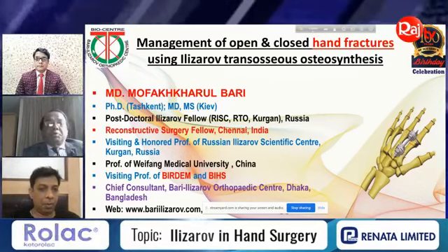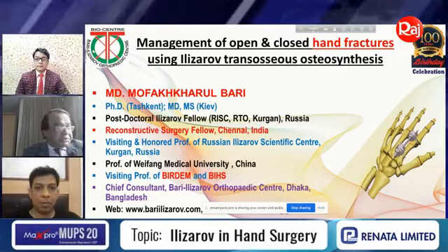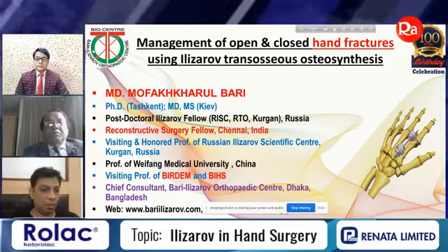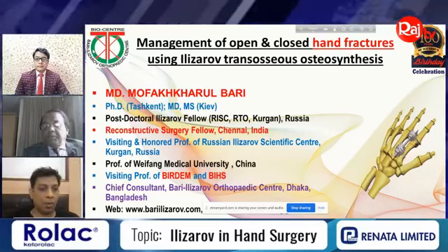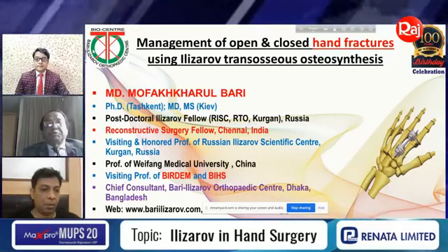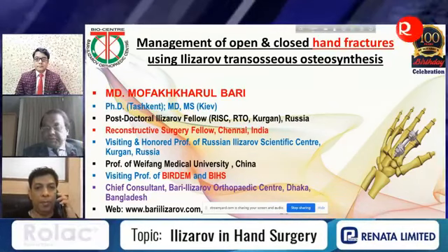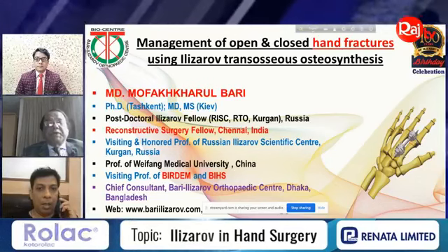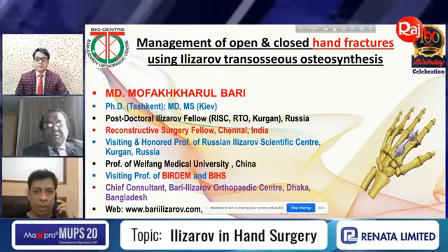Today I'm going to talk on a very important chapter. I'll talk on the management of open and closed hand fractures using transosseous osteosynthesis. Transosseous here means I'll use only wires, no pins.